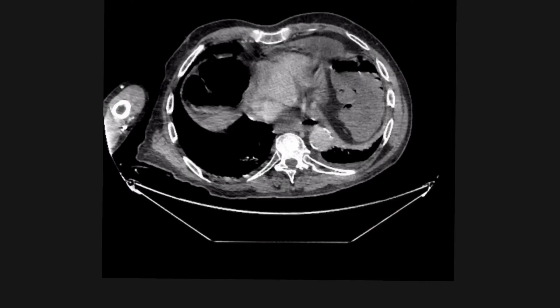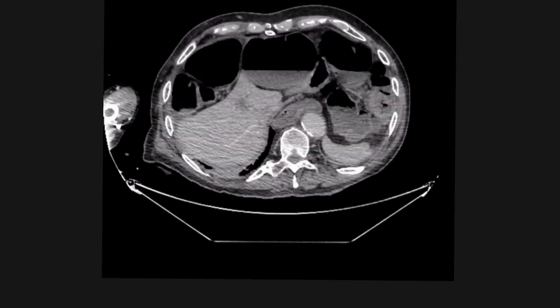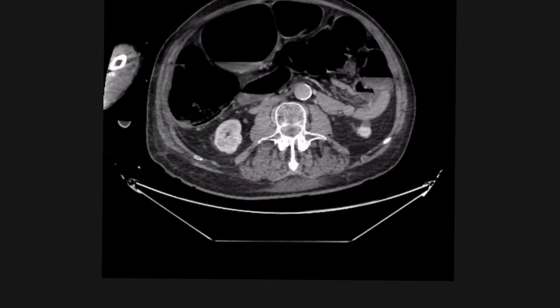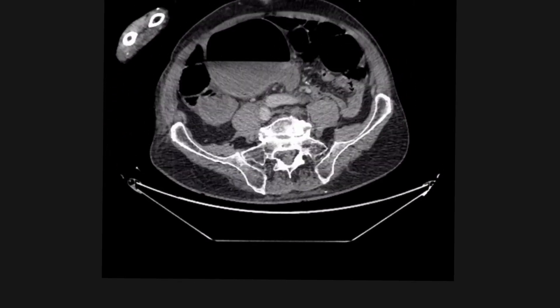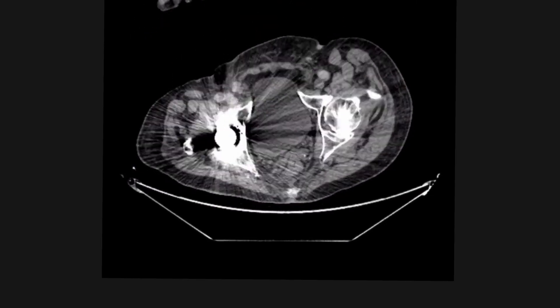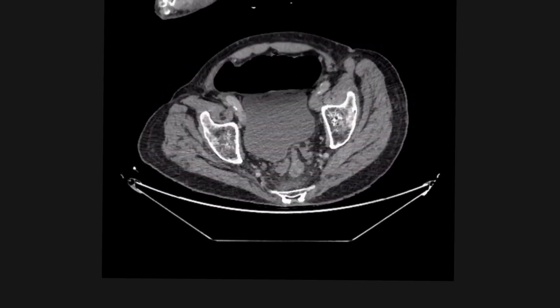However, sometimes you can't tell on x-ray, and you need to do a CT. So if we look at these axial slices on the CT abdomen, we can see all this dilated large bowel. And again, we're looking for a twist. And there is the twist, which is in the sigmoid colon.